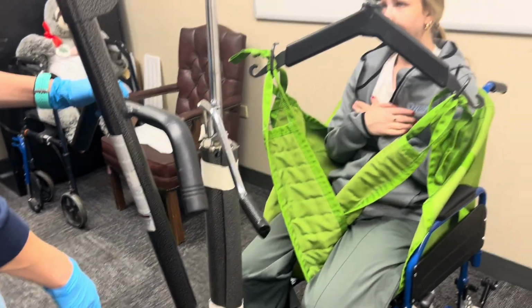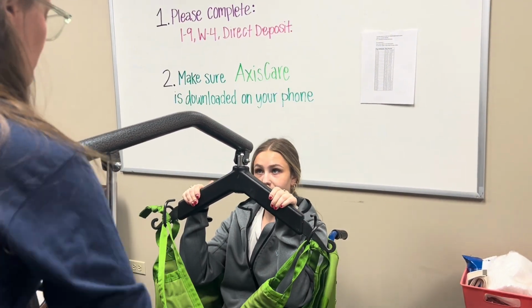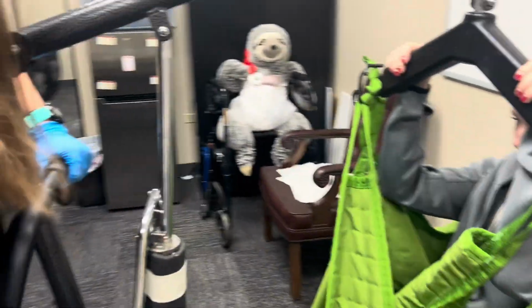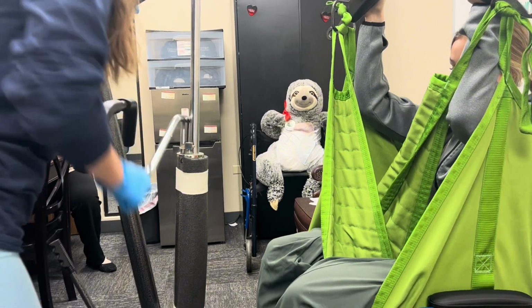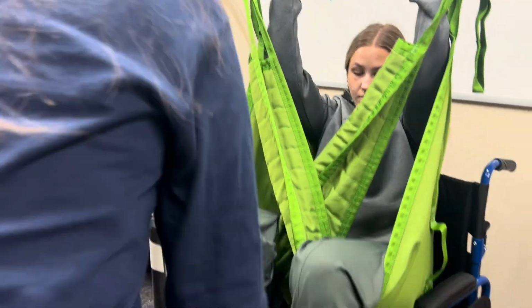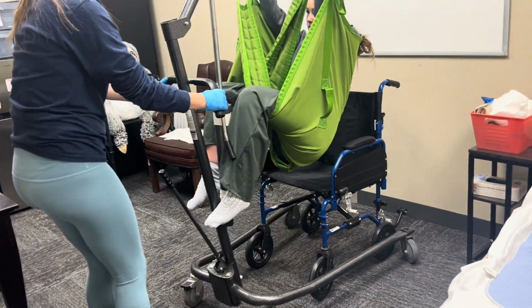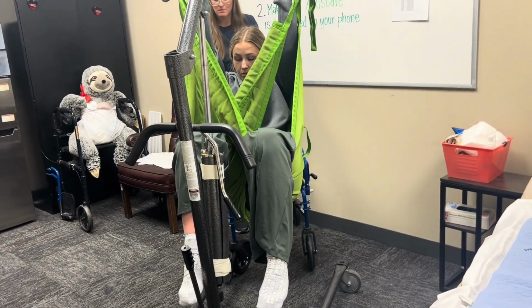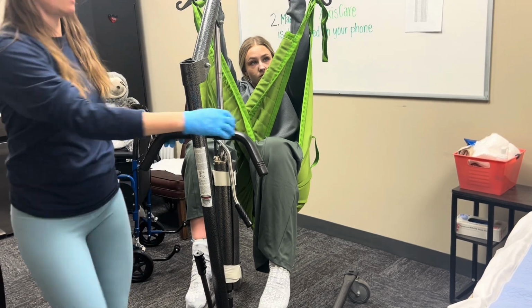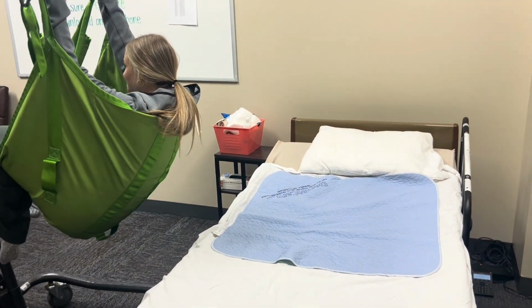Okay, Miss Michaela, you can kind of hold on to the Hoyer lift, whatever is comfortable. We're going to lift you up. Are you ready? Yep. Okay. You might kind of slide into it a little bit more. You okay? Mm-hmm. Okay, we are high enough to clear the wheelchair. I'm going to just put your legs right there. We're moving. Your shoes.